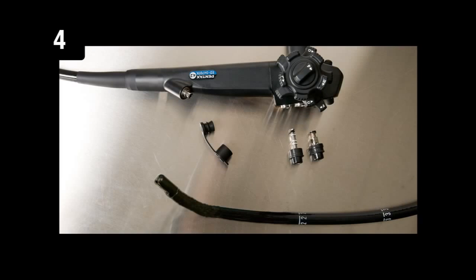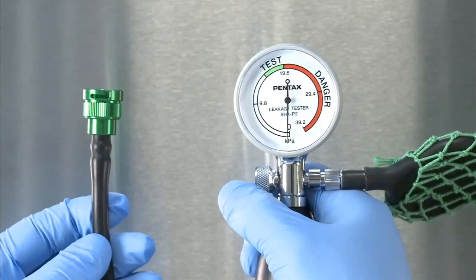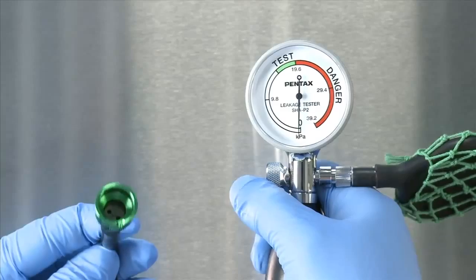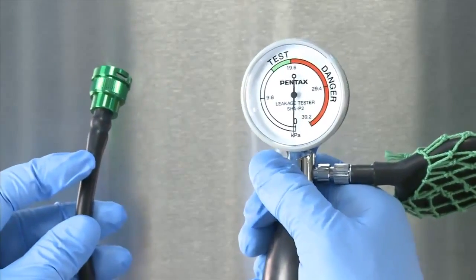Step 4. Prepare to leak test. Detach all removable components from the endoscope and place in enzymatic solution. Confirm that the leakage tester needle is on 0 and verify that there is no moisture inside the cap, gauge, or tubing and that the needle moves without stopping.